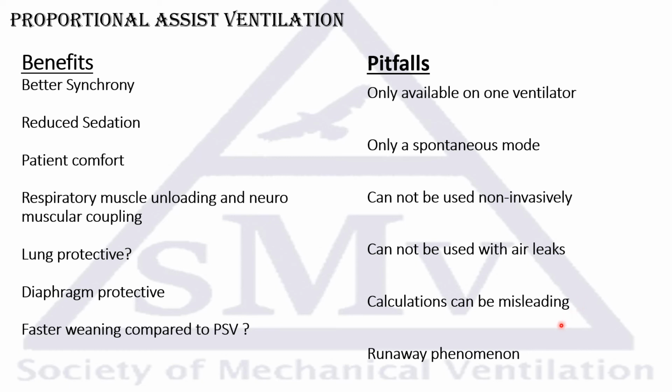There was some problem called runaway phenomena, which really doesn't happen anymore with the new software, and it's basically with cycling dyssynchrony.